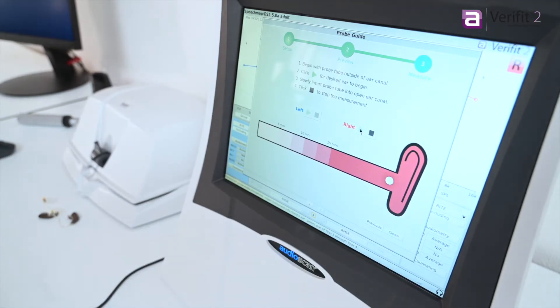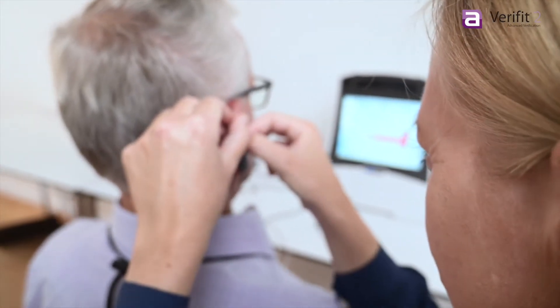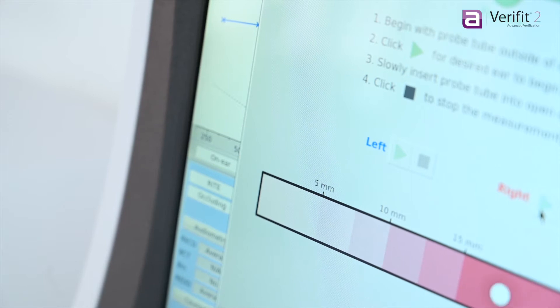ProbeGuide uses an advanced algorithm to help you place the probe tube in just the right spot, to ensure precise verification and a comfortable experience for your client.